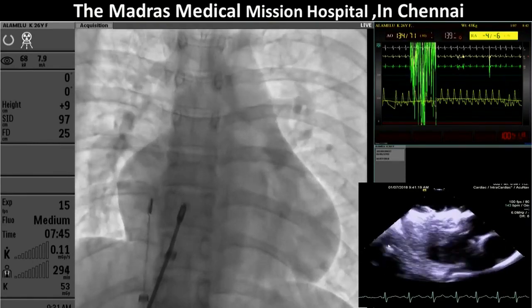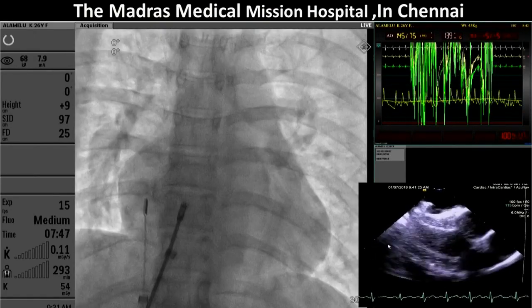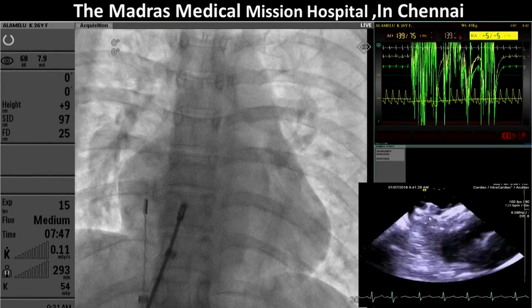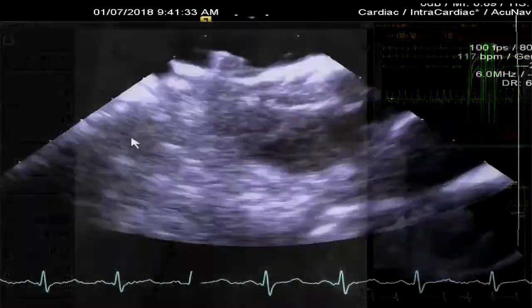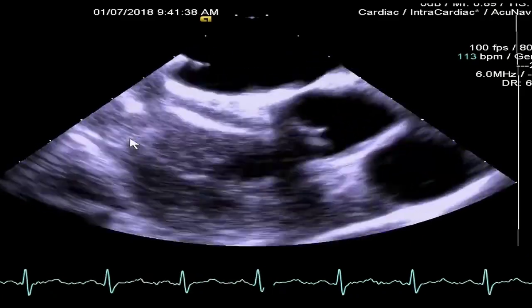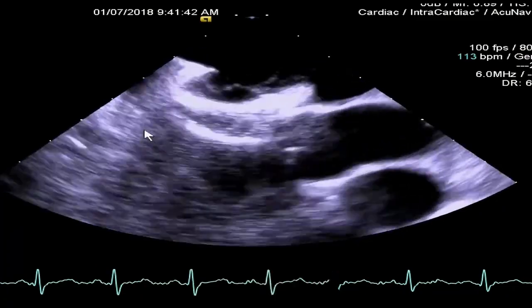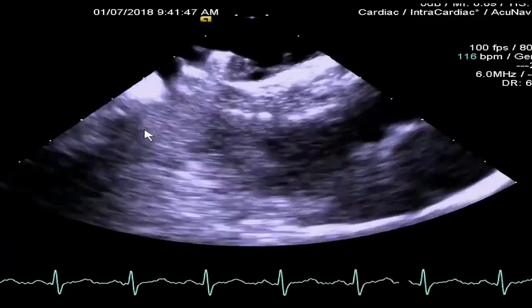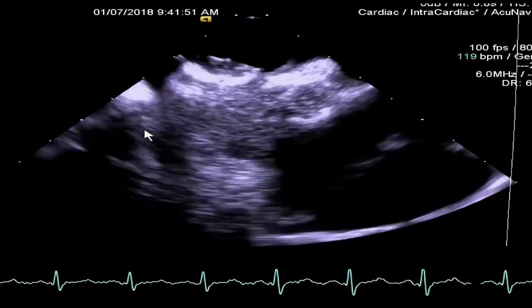So you were, I think, watching the echocardiography in a smaller screen. Can you see that clearly? Yes, you can make it bigger. It is very well deployed. Actually, the left atrial disc is on the left atrial side, and the right atrial disc is on the right atrium, and we can see that the margins are being held by the disc very well. And the way it has collapsed is a good feeling, actually. Color.